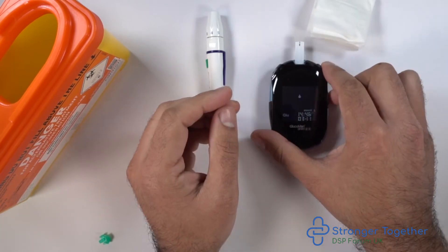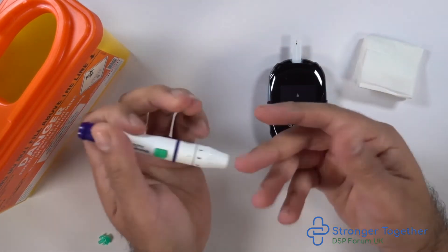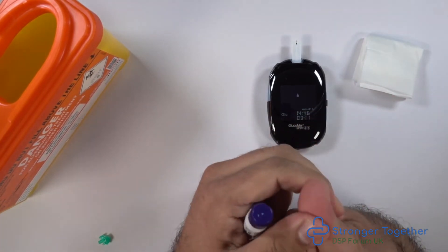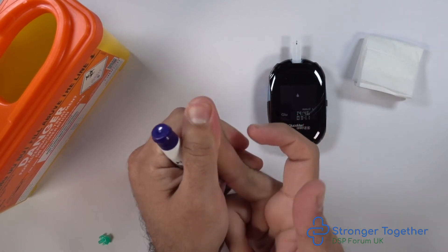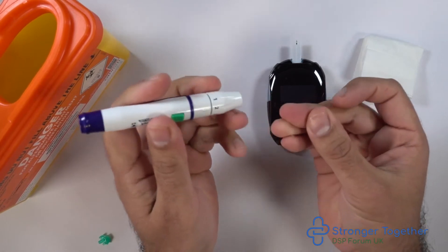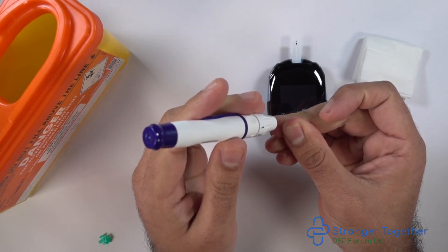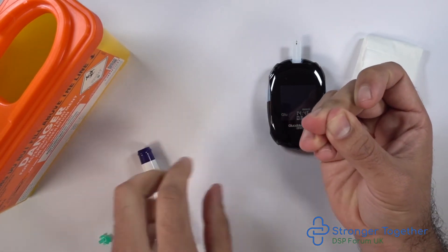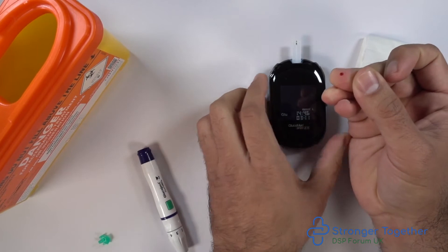Here we have a tissue ready. When getting ready to lance our finger, make sure you have loaded your device beforehand. Remember we'll have washed our hands prior to testing. Remember to rub your fingers as shown here. We can choose any of our fingers for the procedure. Remember to lance your finger on the outside portions of the finger and not on the pad. We then squeeze out the blood drop.